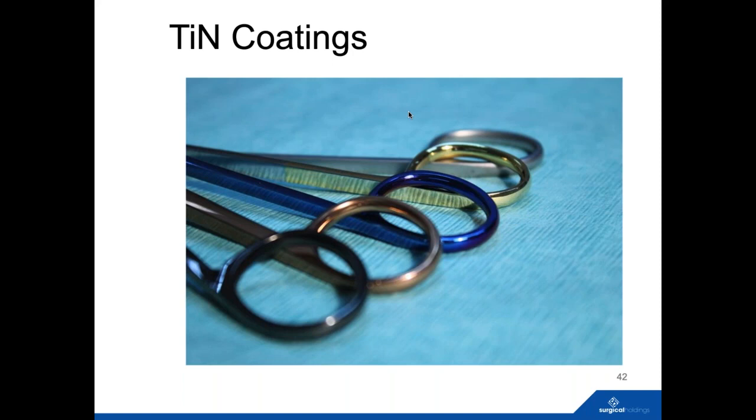Yeah, okay, and I understand. And obviously anything that is seen to be deteriorating, people are going to start to worry that you could get residual bioburden or protein in those areas. Most commonly we see the gold bow there, which would just be like a gold plating, like gold plated jewelry. But you can get more robust gold coatings that, as Bob mentioned, like a gold and black titanium nitride, which are very strong and generally won't come off.